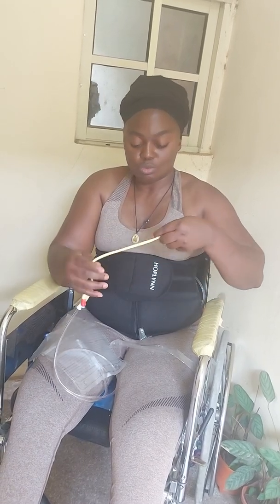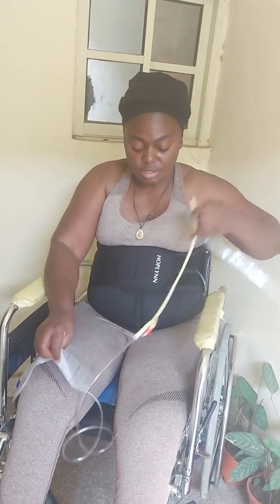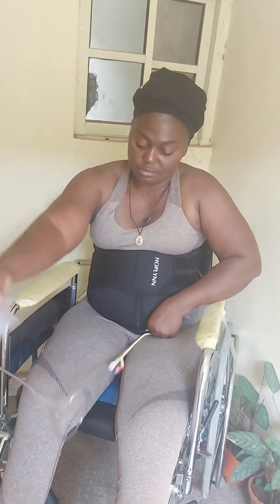Remember that this one goes inside. If it's suprapubic, this one goes way inside, but it will be inflated with injection water to avoid pulling out. But that's not what we are talking about today. If it's the urethra, it's the same thing. So now this one pulls out. You see it.